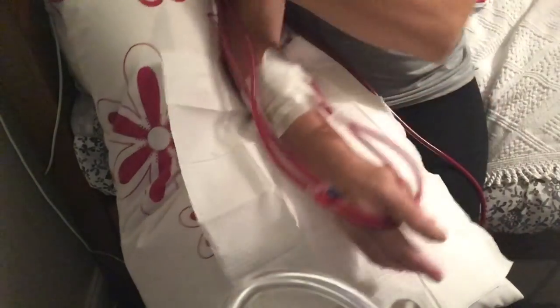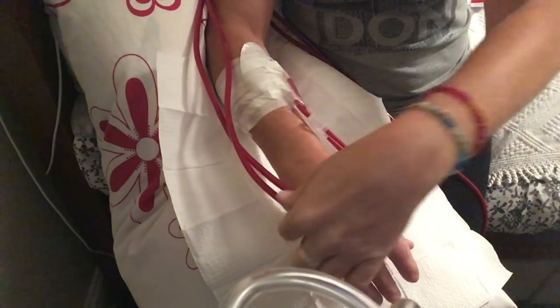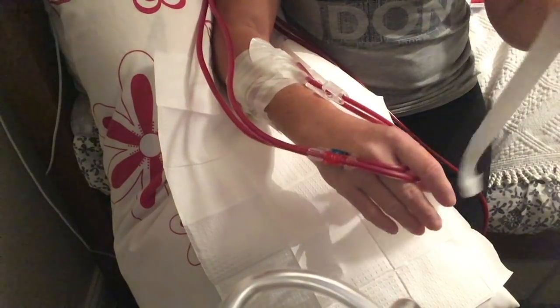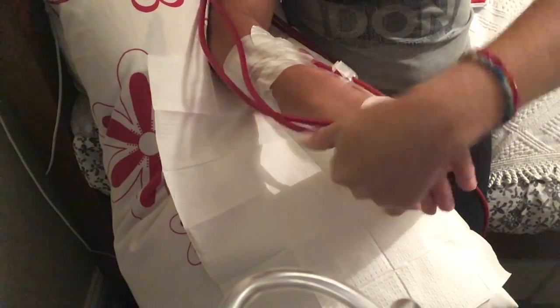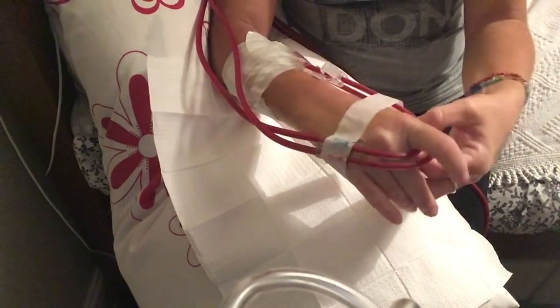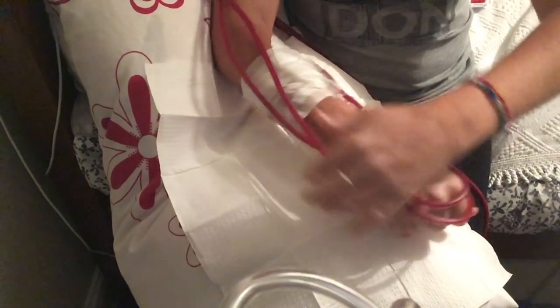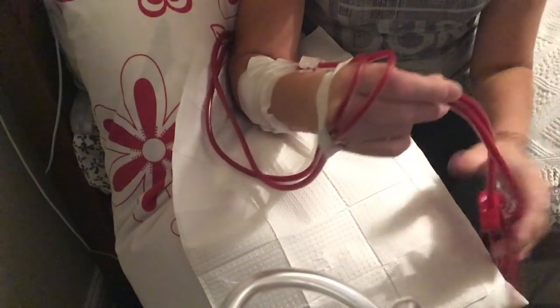What I do is tape the lines. I first tape around my hand, and I tape across the connections as well, just to make sure there's no chance of them coming loose or undoing during the night. So that's the first bit — right over those connections securely and then around my hand, so it's held there. Then I unravel the lines as much as I can and tape up my arm.